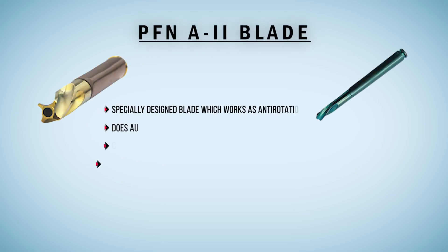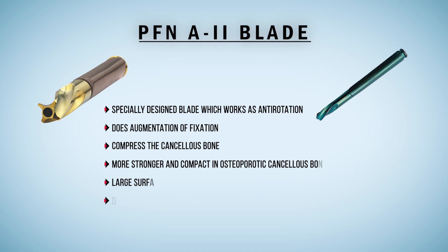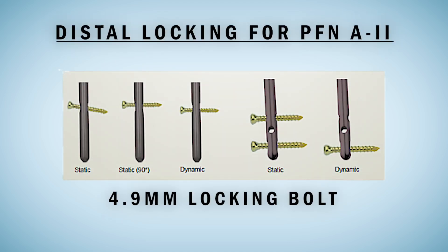This is the PFN blade — a specially designed blade which works as anti-rotation, provides augmentation of fixation, compresses the cancellous bone, and makes a stronger and more compact construct in osteoporotic cancellous bone. Its large surface area gives better purchase and dramatically decreases the risk of cutout. The locking option of the blade makes a more stable construct. For distal locking of PFN A2, a 4.9mm locking bolt is used. For the shorter version, there are three options: static, static 90-degree, and dynamic. For longer nails, there are two options: static and dynamic.